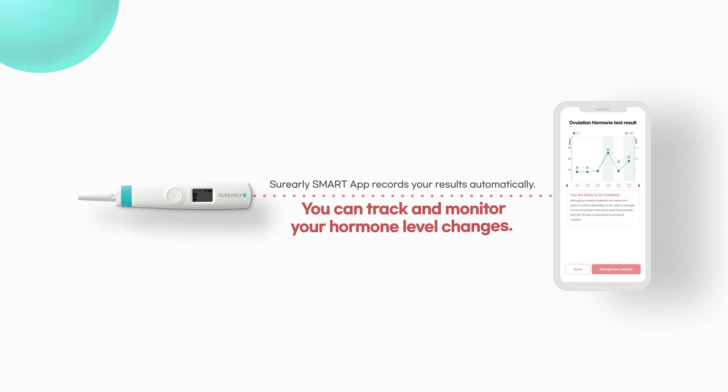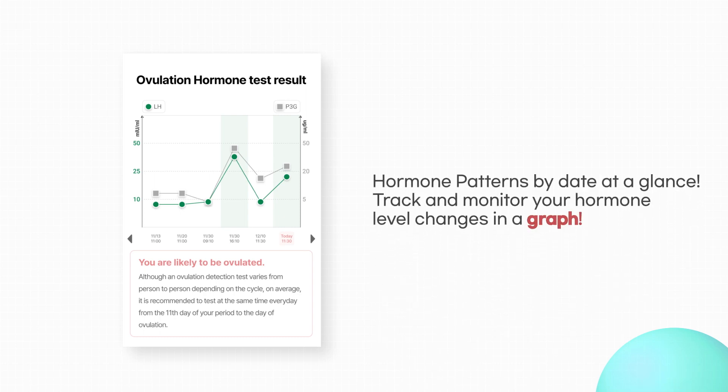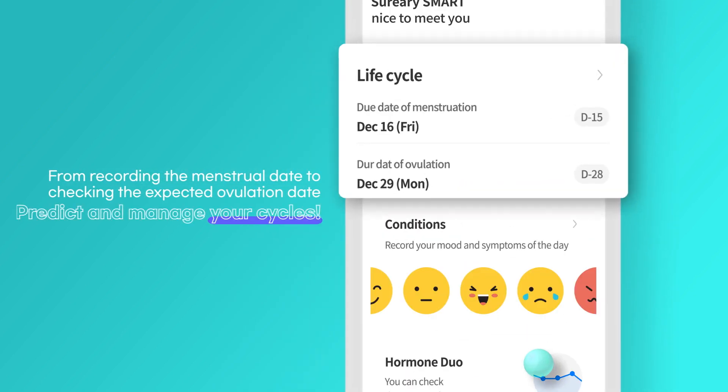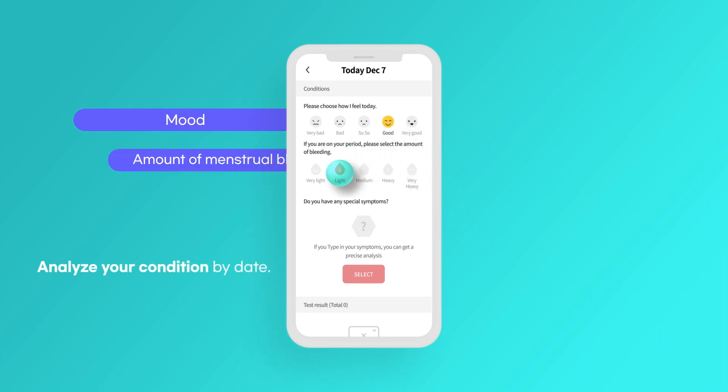Test results are automatically recorded and managed by the app. The results can be viewed at a glance in graphs. Using the calendar, you can predict and manage your menstrual cycles. You can also manage your conditions by analyzing symptoms.